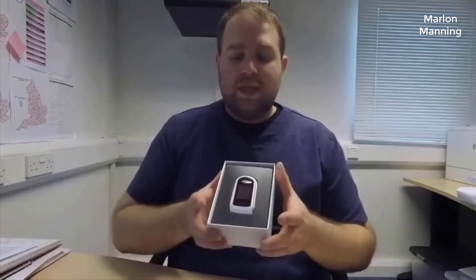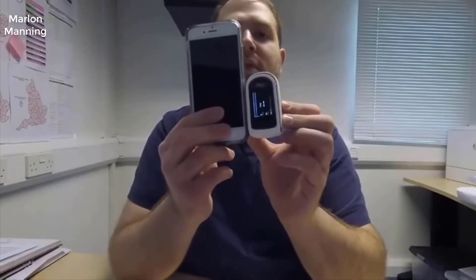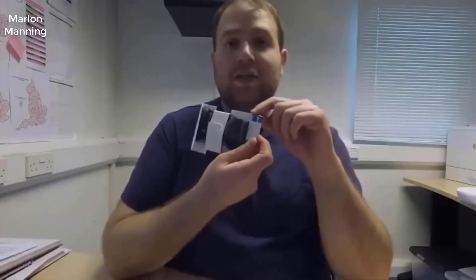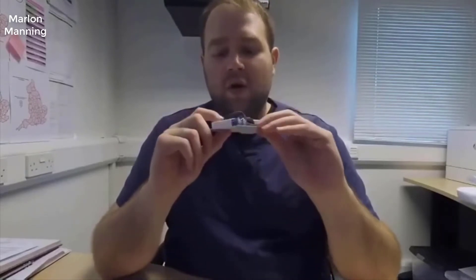So let's have a look at the device. As you can see in the box, you have the device itself here, and that's pretty small. Let's compare it with my iPhone 6s — it's very, very small. Inside the box you'll also find an instruction manual (never forget to read it), two batteries, a bag to carry it around, and a wrist or necklace strap.